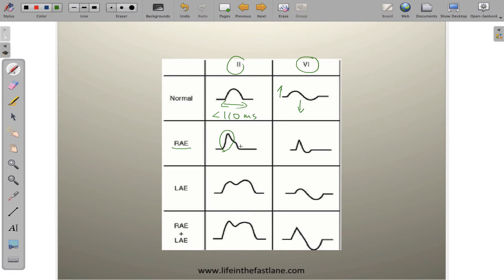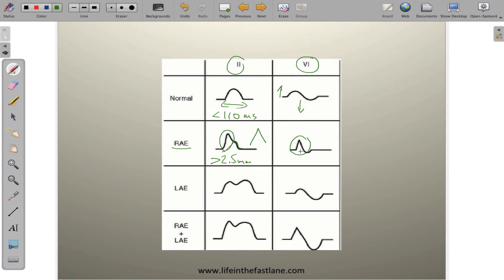That is followed by a lesser-tall peak representing left atrial depolarization. So right atrial enlargement gives you an increase in amplitude — greater than 2.5 millimeters — with a peaked shape. In lead V1, it's this early portion of the P-wave that increases, representing the right atrial contribution.